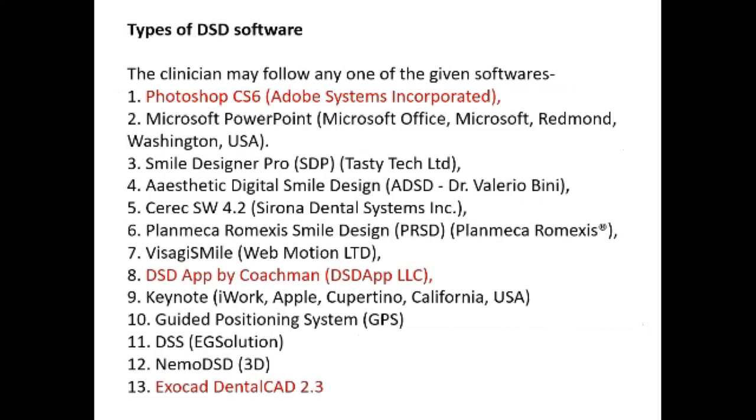So what are the softwares in it? There are different types of softwares in the market, and Photoshop is a gold standard software which can be used for digital smile design. And there is a digital smile design DSD app by Christian Coachman himself, and ExoCAD Dental can also be used. So it is about your application skills rather than the software. And this Photoshop will be readily available. And if you are a DSD official member, you can get access to the DSD apps and the softwares.